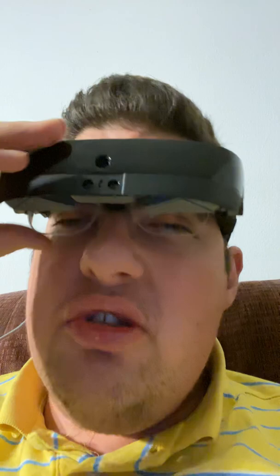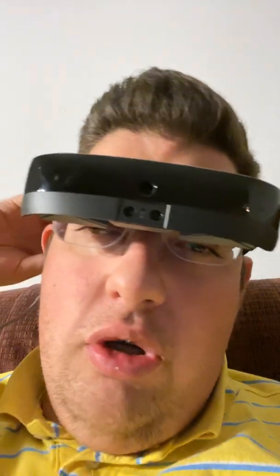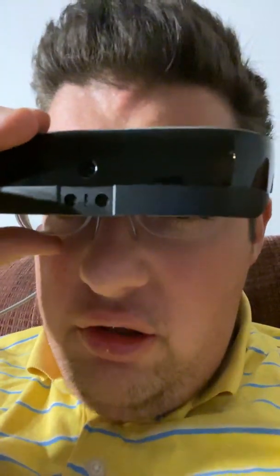This is the headset piece. A lot of people call it Geordi LaForge-style glasses, and it does have that visor look. It tilts all the way down — that's completely down in front of my eyes. It does tilt up too, and I like to keep it about here and look straight down. This is the front of the headset, this is the camera, and behind here are the two screens.